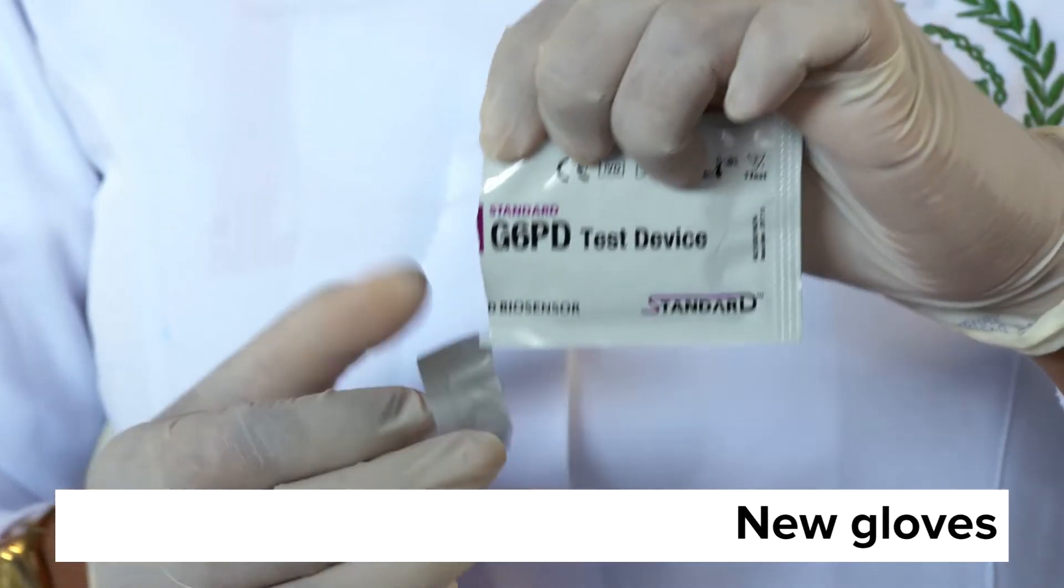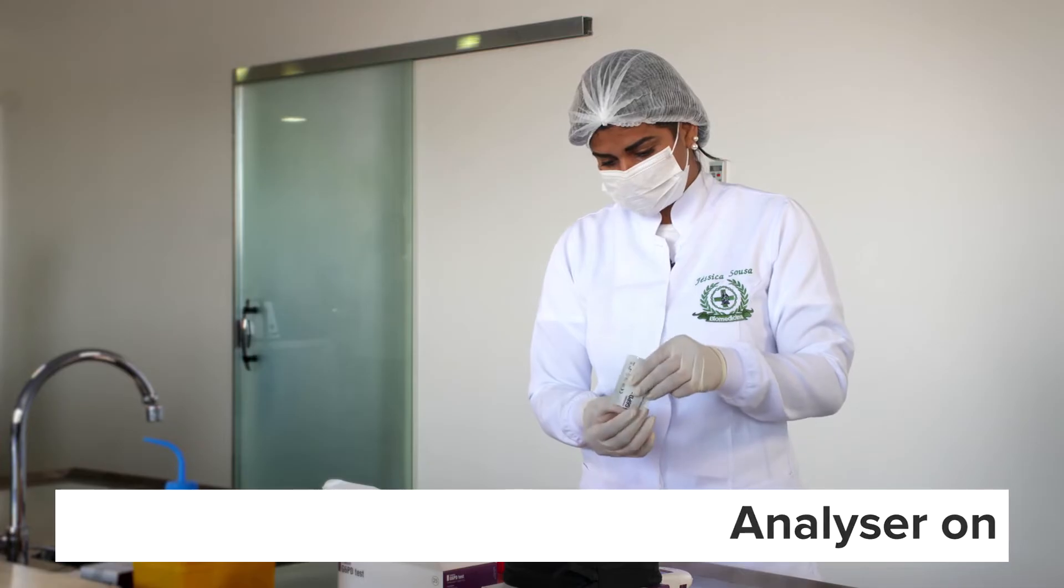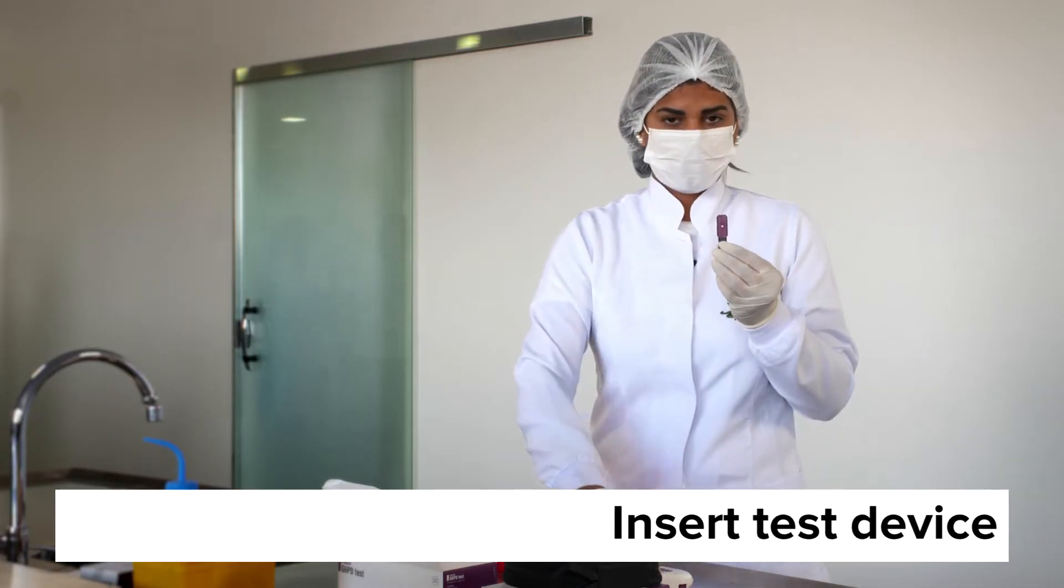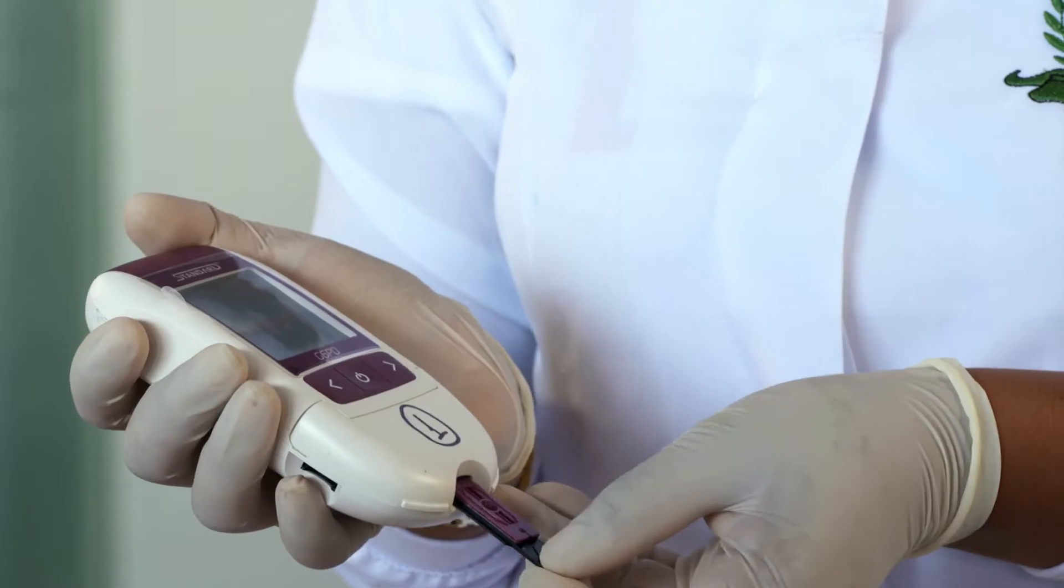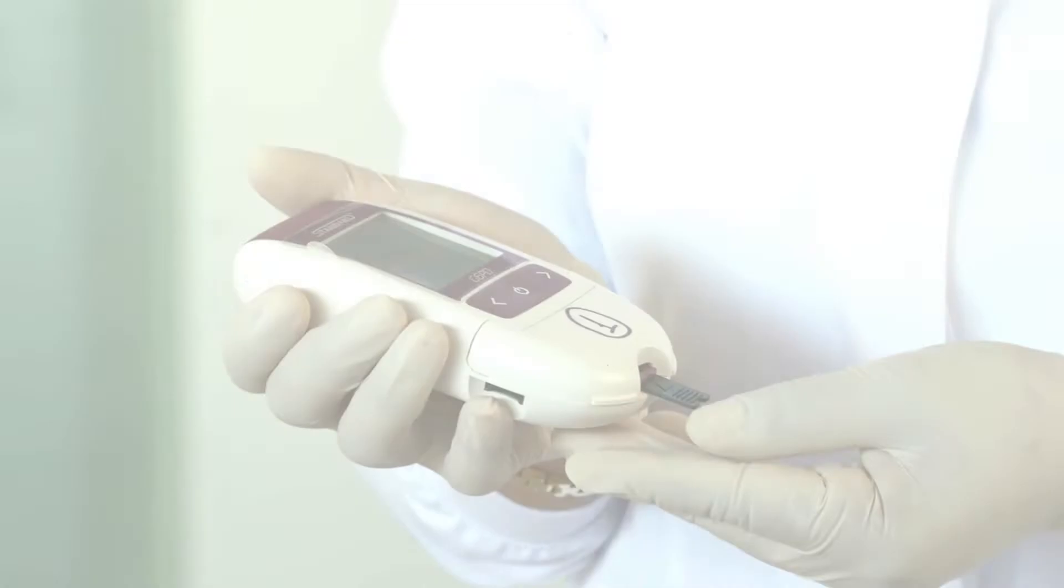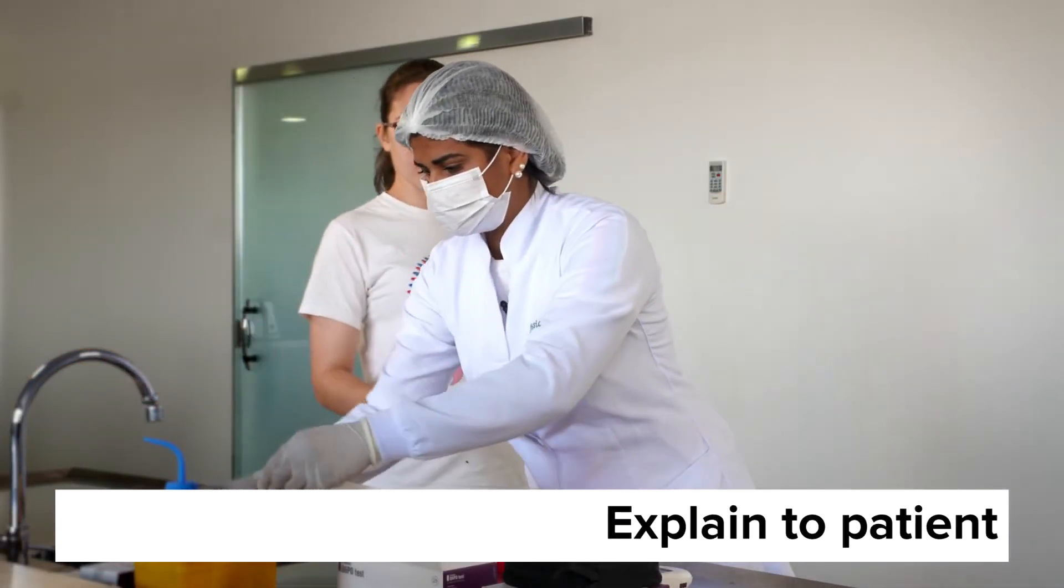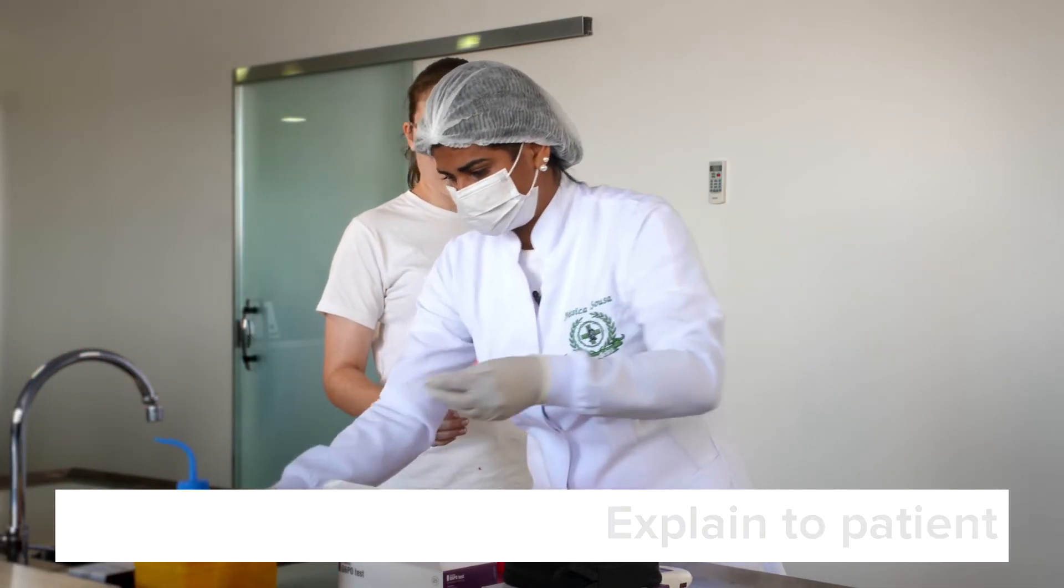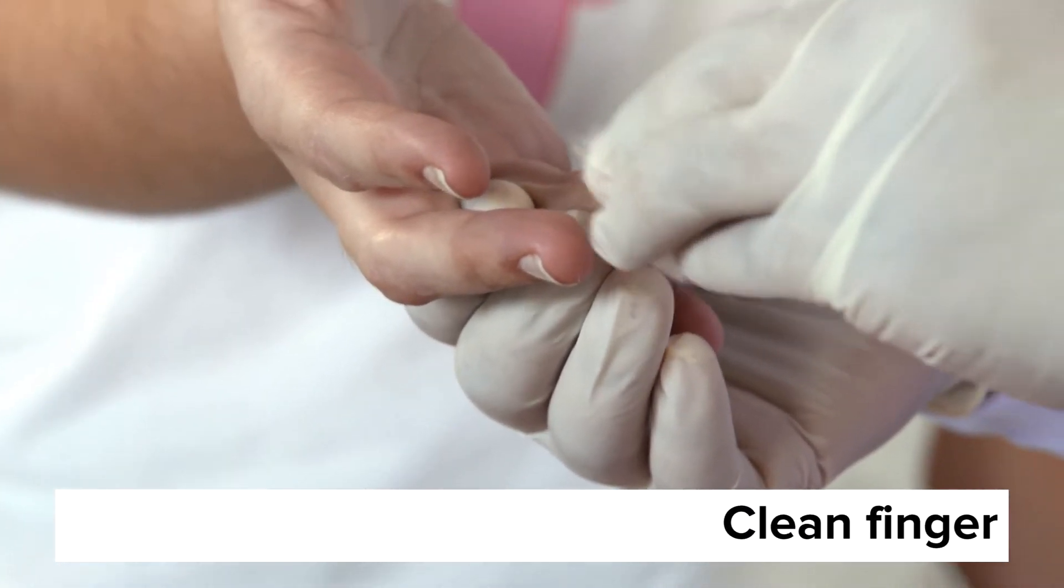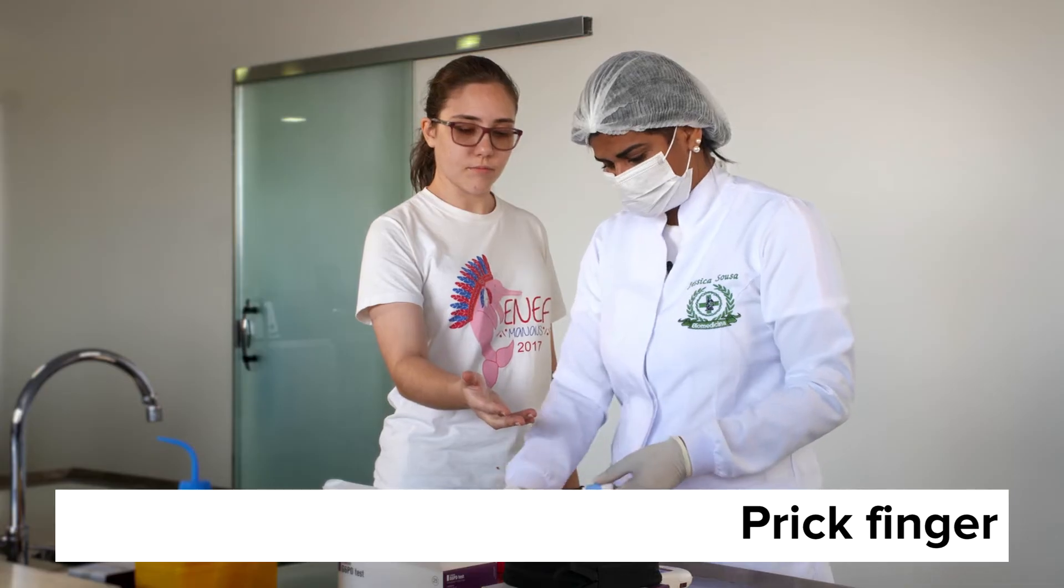Using new gloves for each patient, turn the analyzer on and insert the bigger part of the test device into the analyzer. Explain to your patient why and how you are doing the test and clean a finger of their non-dominant hand with an alcohol swab and allow to dry. Then prick the patient's finger.